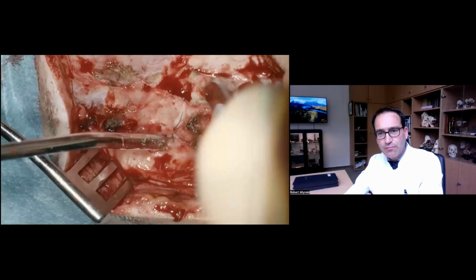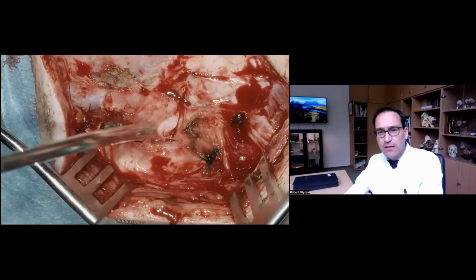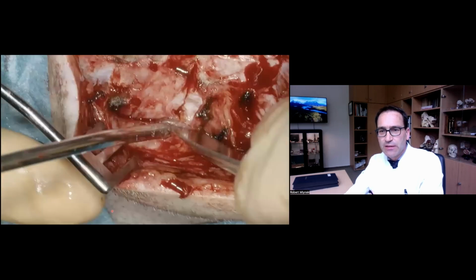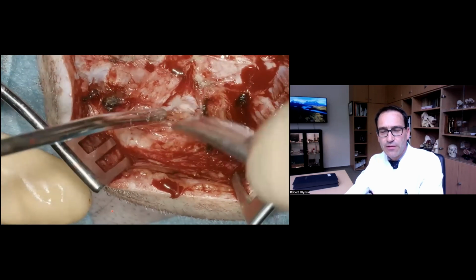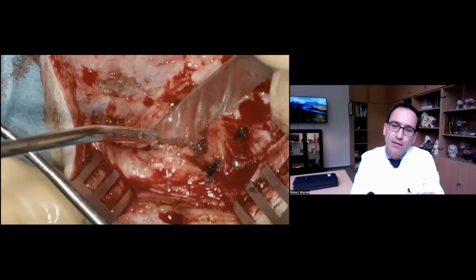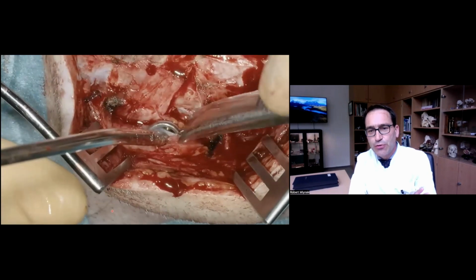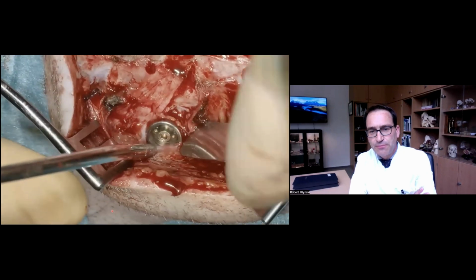So, a sharp incision on the skull, and then using a raspatory to displace the pericranial connective tissue. And it is necessary to fully expose around the former implant, expose the former implant completely. So we have to really make sure to have a circular view around the implant.